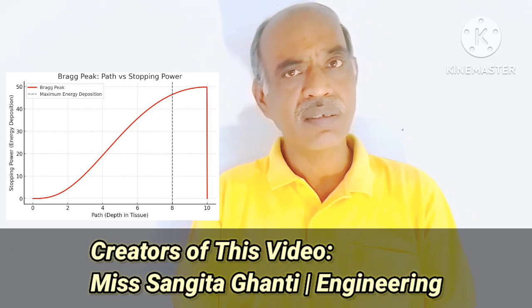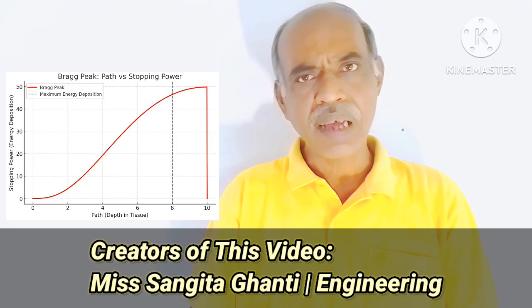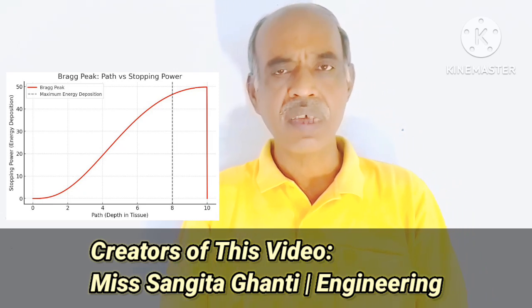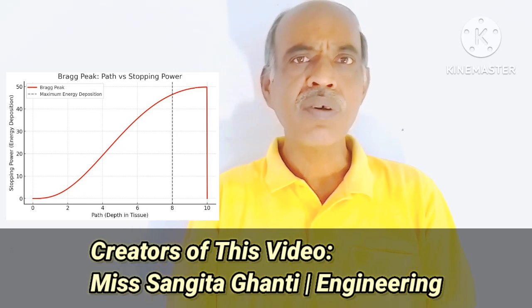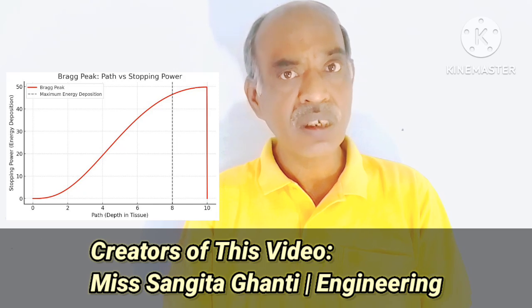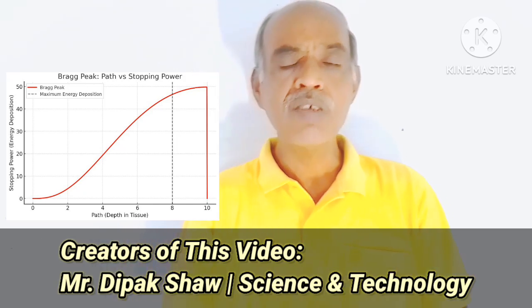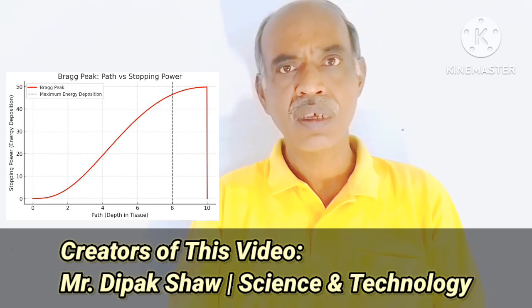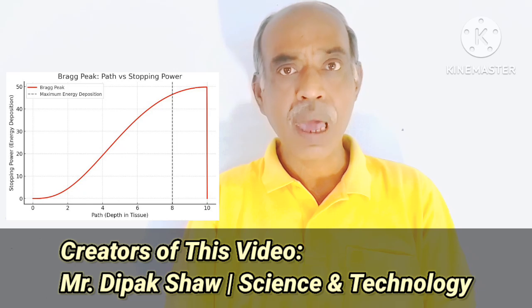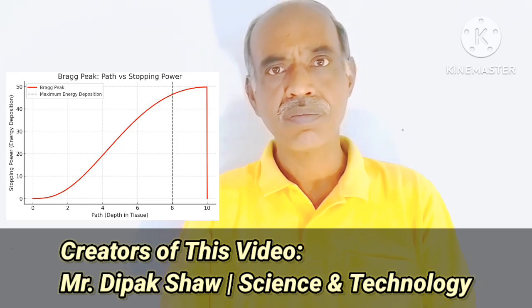But the interesting thing is that when the proton beam goes inside your body, at the very beginning it loses very little energy to the tissues. So while it is passing through the healthy tissues, damage to the healthy tissues becomes less.